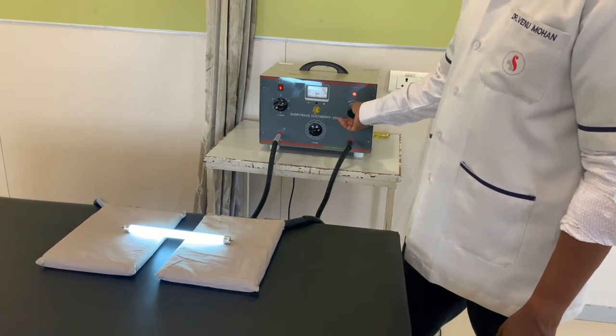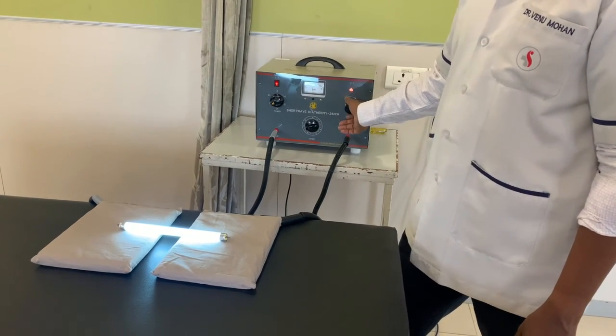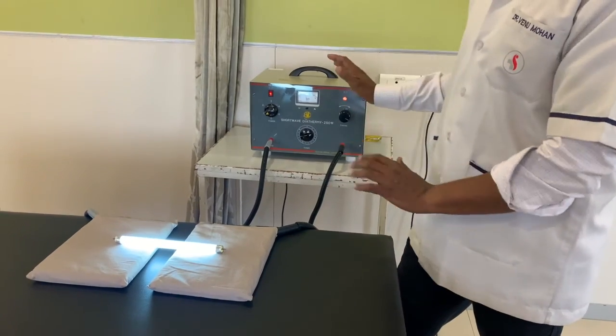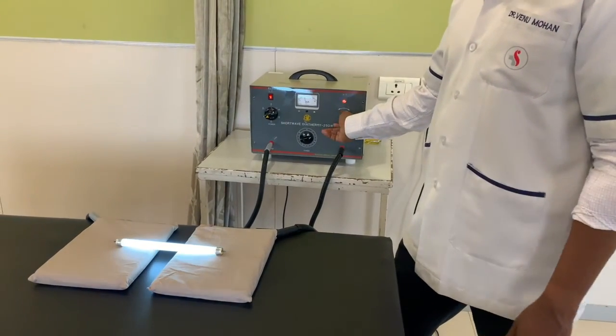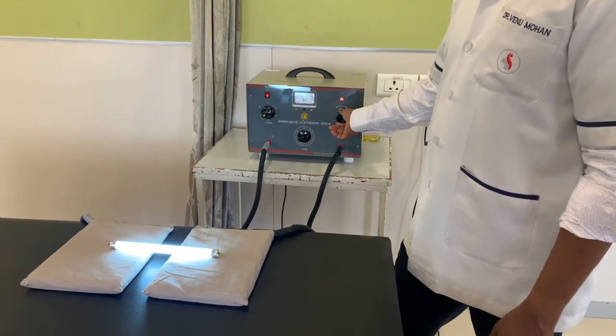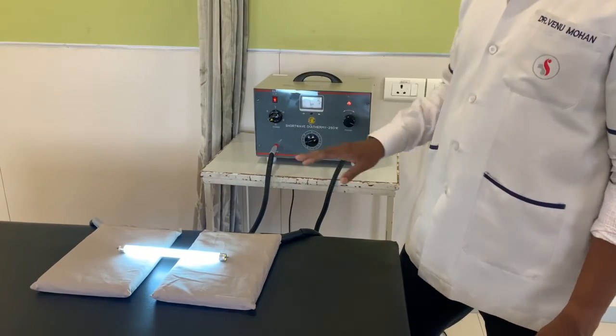And same thing, I see that the ammeter is showing me the reading, and there is a point at which it is showing the maximum reading. This time I say that the machine has tuned. Now if I mistune it, you can see the glow is decreasing. The point where you see the maximum glow, that is the point where you say the machine has tuned.